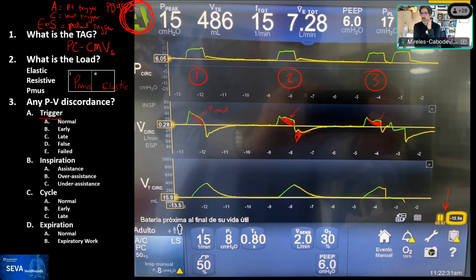And Arsal, you referred to the trigger, so we're on the trigger phase. So when you say normal trigger, do you want me to explain? You unmuted, so release the beast.